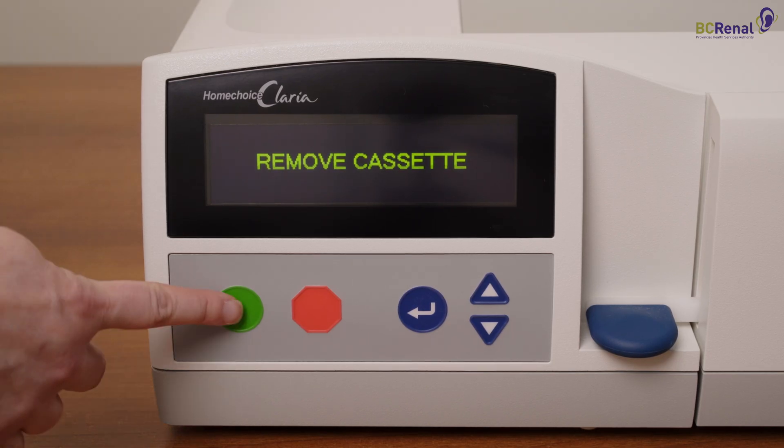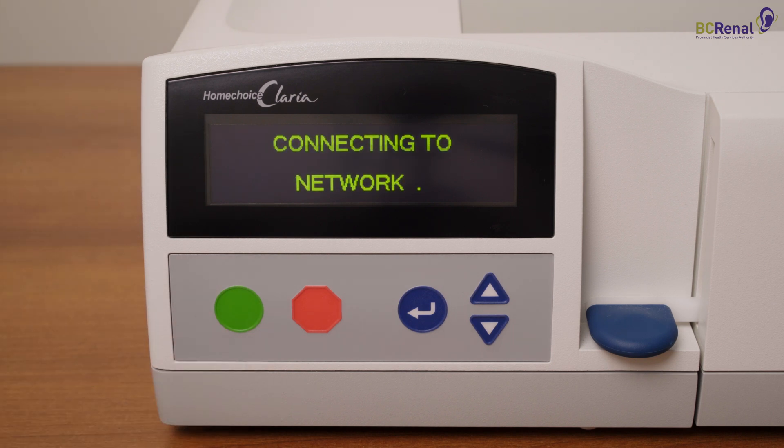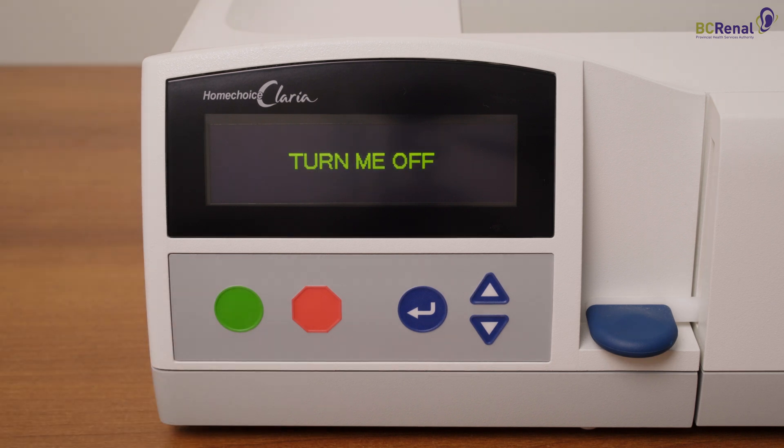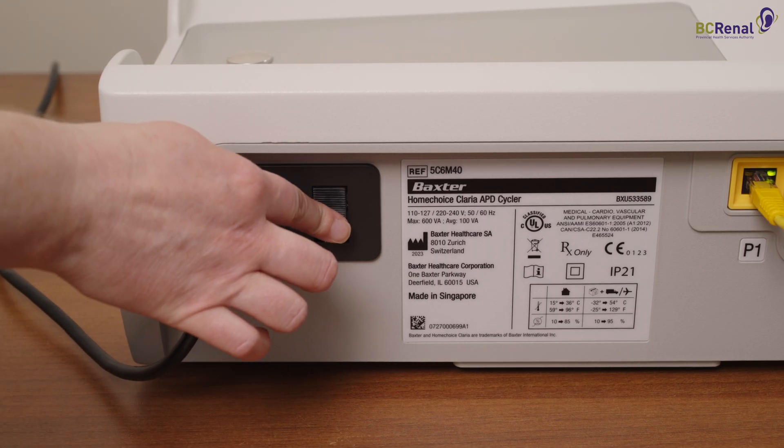Press the green button. The display will say: connecting to network. When the Cycler is finished, "turn me off" will appear. Turn off the Cycler using the on-off switch at the back of the machine.